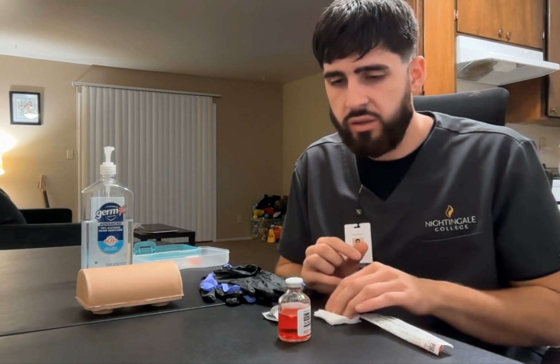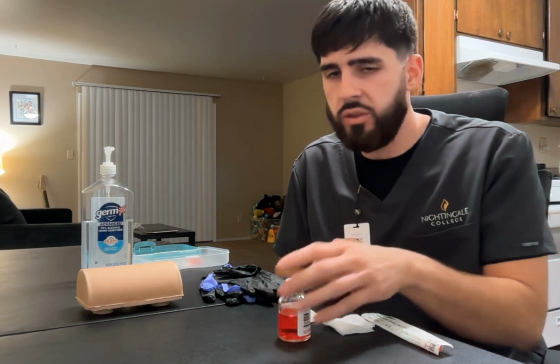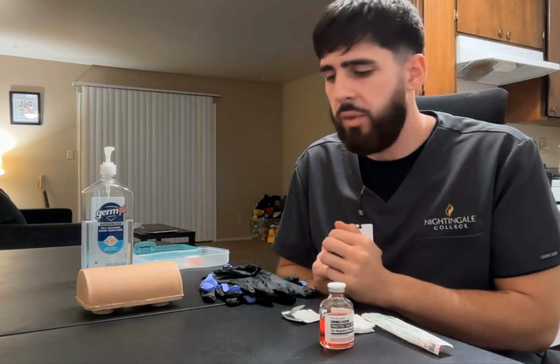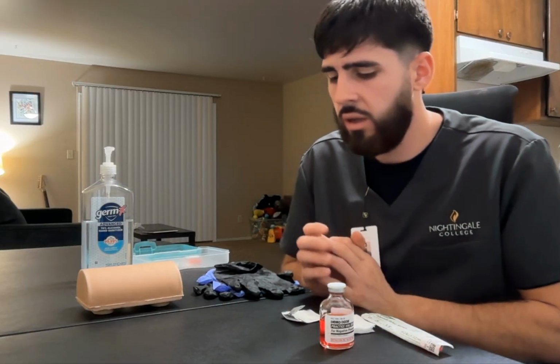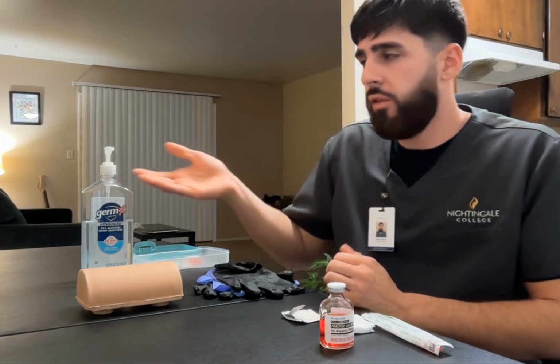So now I have my syringe. I'm bringing gauze pads and alcohol wipes, as well as my drug that I've checked up to my patient's MAR. And I'm going to head to my patient's room, set this down on the counter, close the door or the curtains behind me to provide patient privacy. I'm going to go ahead and perform hand hygiene, introduce myself to the patient.